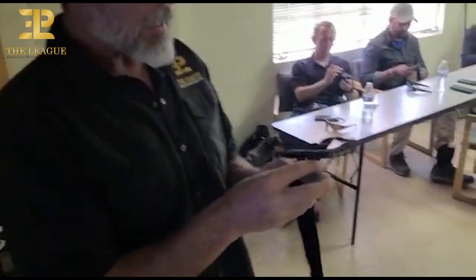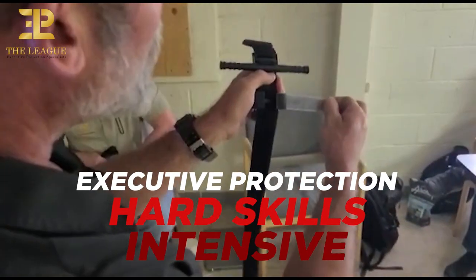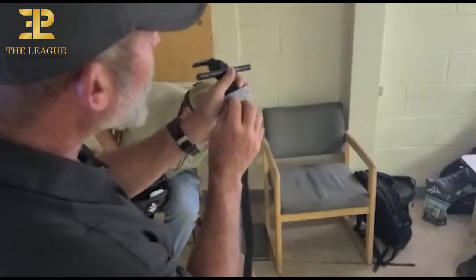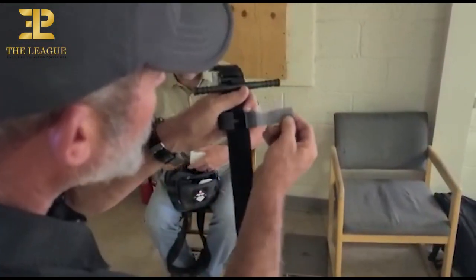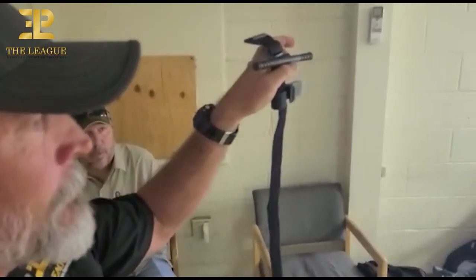So the tourniquet. Take this tab — this gray tab that says 'time.' This is what you're going to use to lock up the windlass after we're done. But this is not a ready state. Take this off and over to the side, just like that.